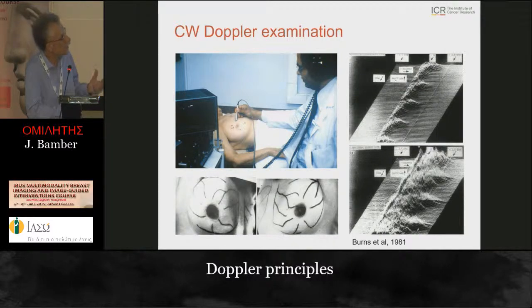And you get a much more pulsatile result in the case of some of the benign tumours where the vessels are behaving normally. You can also map out, a lot of time was being spent in these early days exploring the vascular network patterns and showing that in a single patient, the vascular pattern that you could map out if you took the time to do it was very symmetrical on both sides.